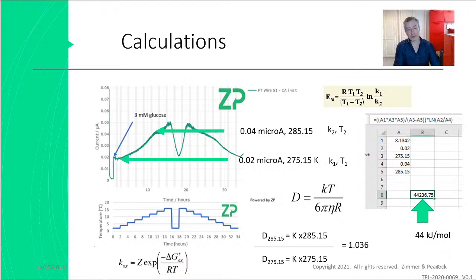And so I would consider this a question two-thirds answered, even though it wasn't the original question, because the original question was, why is a pH sensor temperature sensitive? I can answer that quite easily by looking at the Nernst equation, but I haven't done that. I misread it. The question was, why is a biosensor, and therefore I think a glucose sensor, temperature sensitive? And I think it's because the enzyme is temperature sensitive. And this is not a bad justification for that opinion.